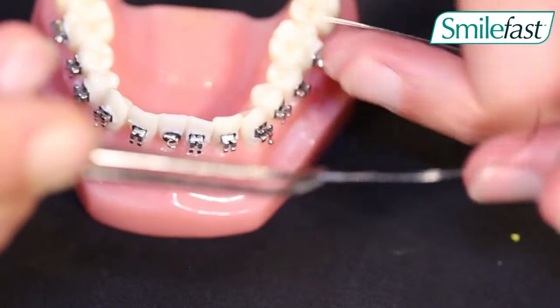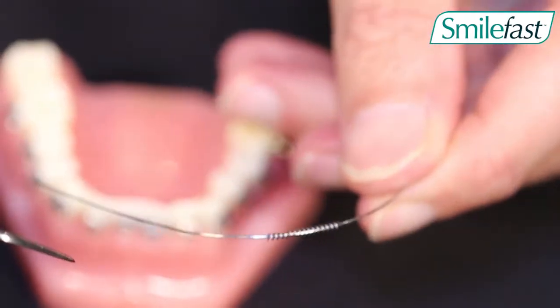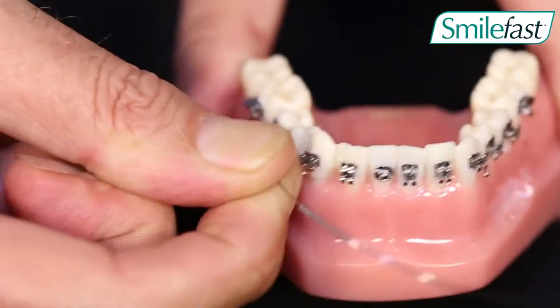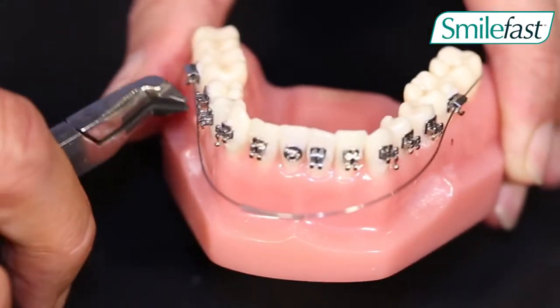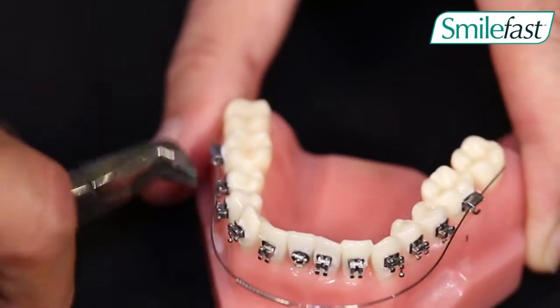We cut that spring to that desired length, we slide it onto the arch wire, then we go ahead and tie the arch wire in by placing it in the molar tubes first, cutting the wire with a distal end cutter to be sure it does not cut the patient's cheek.